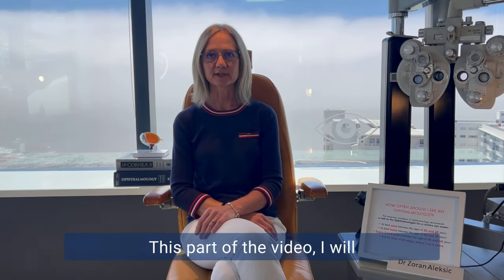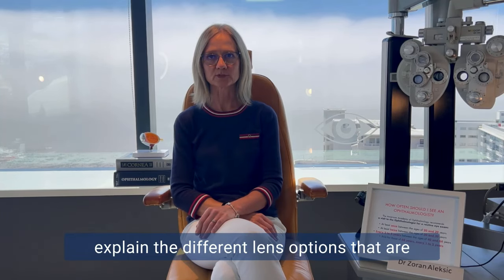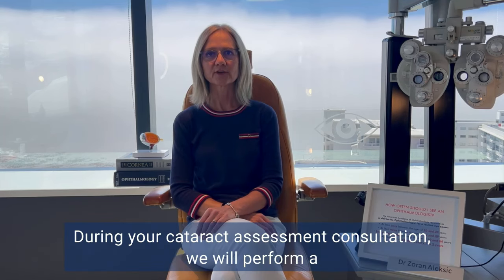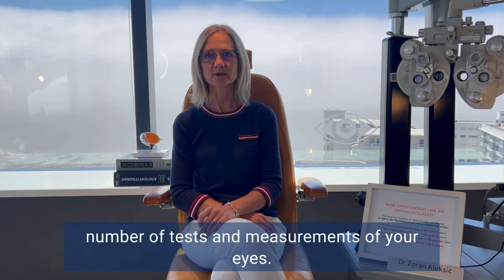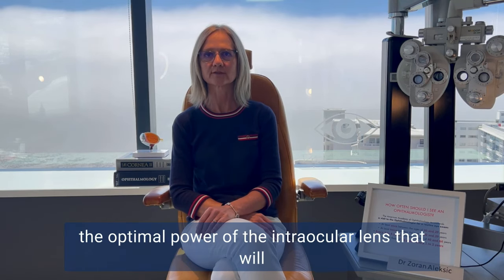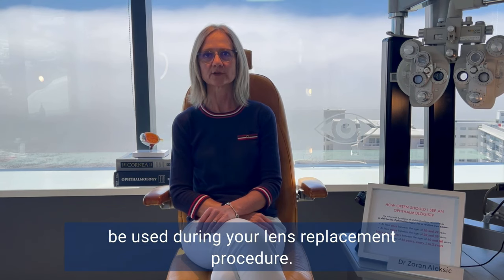In this part of the video, I will explain the different lens options that are available to you during your cataract surgery. During your cataract assessment consultation, we will perform a number of tests and measurements of your eyes. This information is used in specialized formulas to calculate the optimal power of the intraocular lens that will be used during your lens replacement procedure.